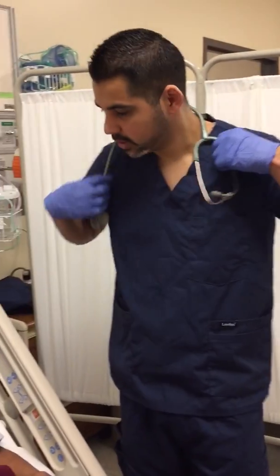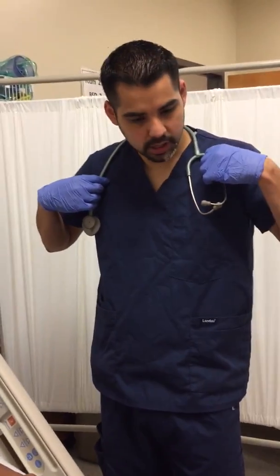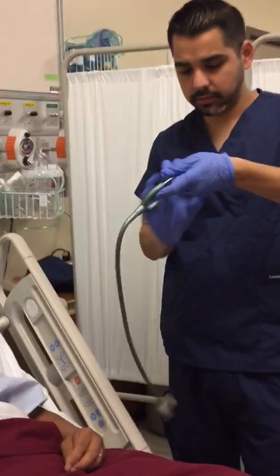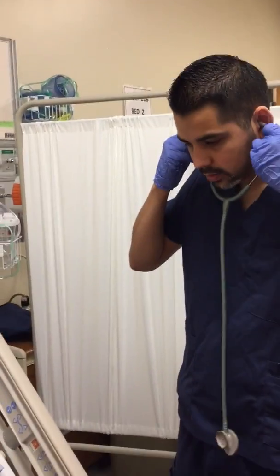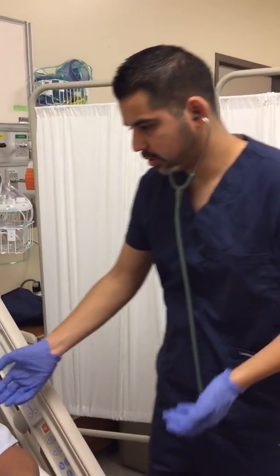His saturations were 98%, so that's pretty good. His pulse went down a little bit, to about 76, so that's a lot better. And his respiratory rate went from 20 to 12. All right, and now let me listen to your breath sounds real quick. After that, I'm gonna take your blood pressure one more time, okay? So I'm gonna be listening to the back. I'm gonna just turn it to the side.